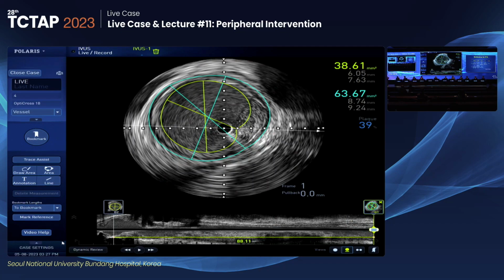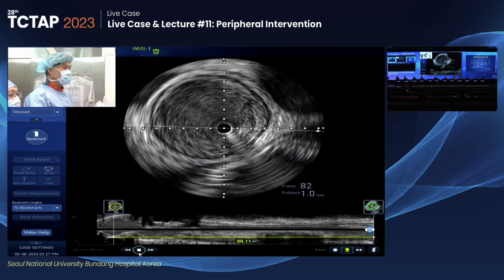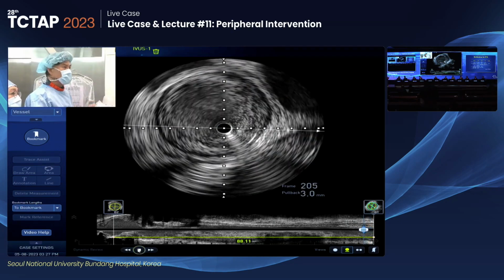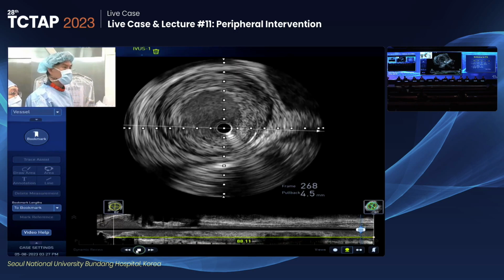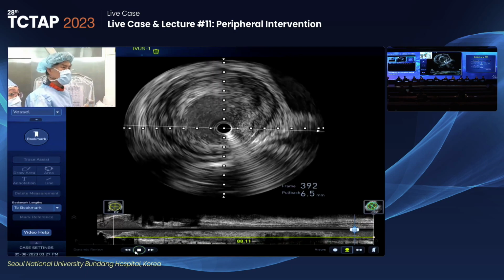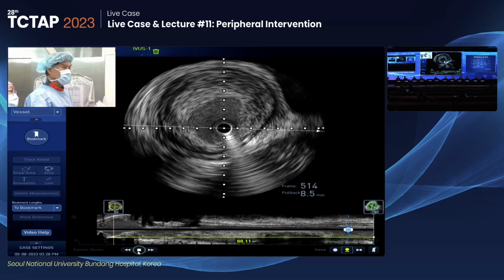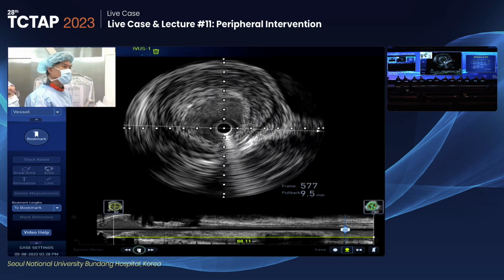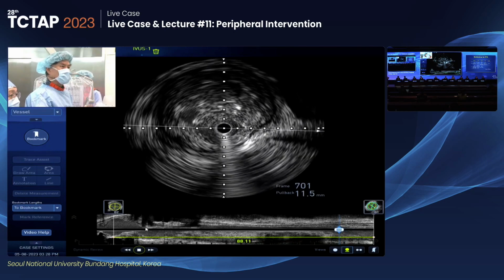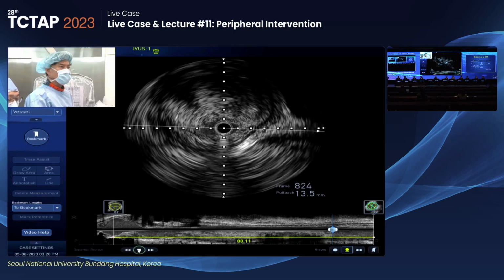So the main intention was to decide the stent reference diameter, and also to show my wiring is intraplaque, where it's showing the zigzag, partly involved in the adventitia or the subintimal space, or any eccentricity, the plaque burden, and part of the organized thrombi, and where the presence of fresh thrombi.